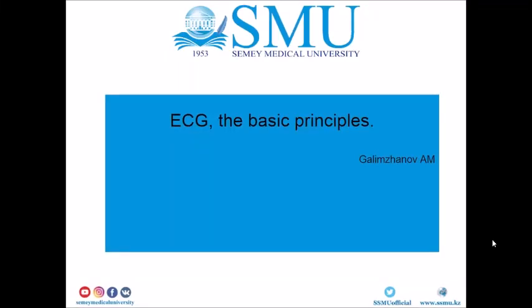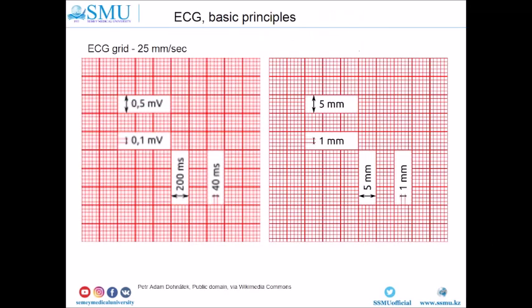Hello everyone! Today I am going to explain the basic principles of ECG. ECG is a method for registering electric activity of the heart.